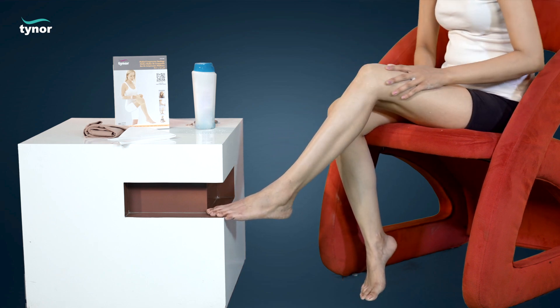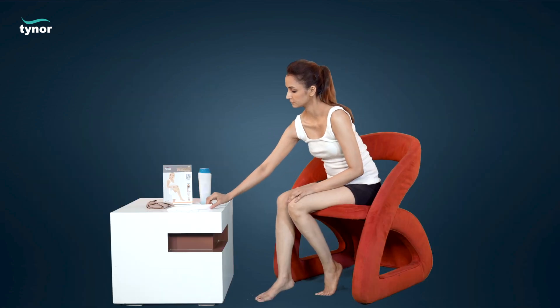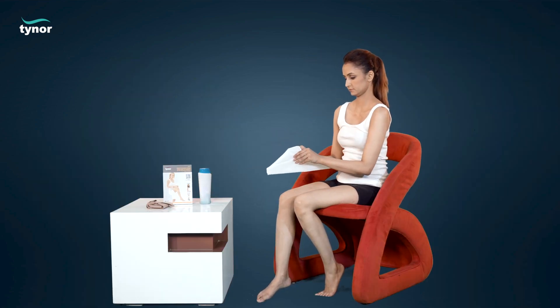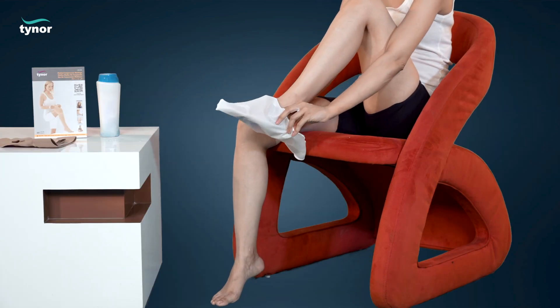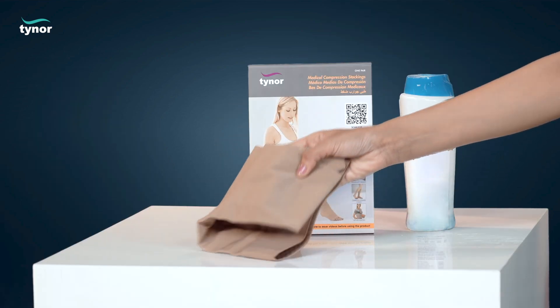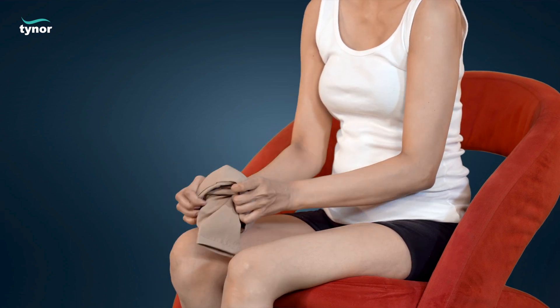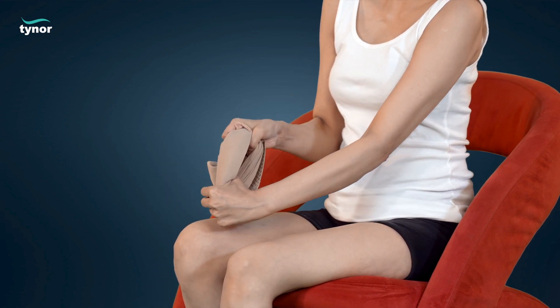Now use an applicator to slide the stockings. Broaden the mouth of the fabric cave so formed.